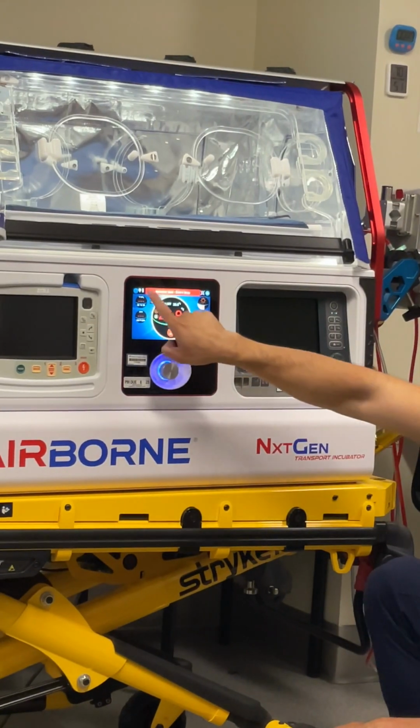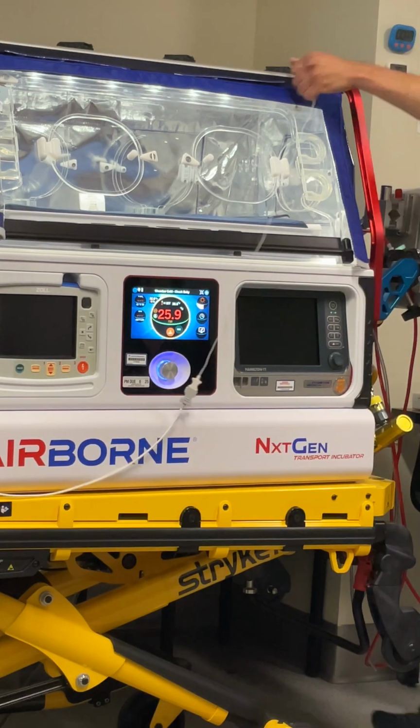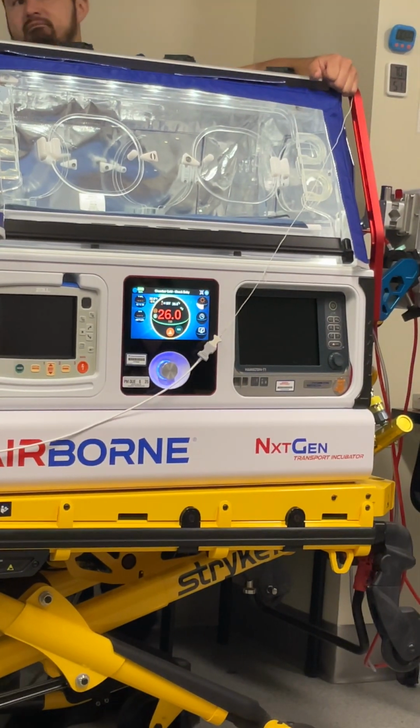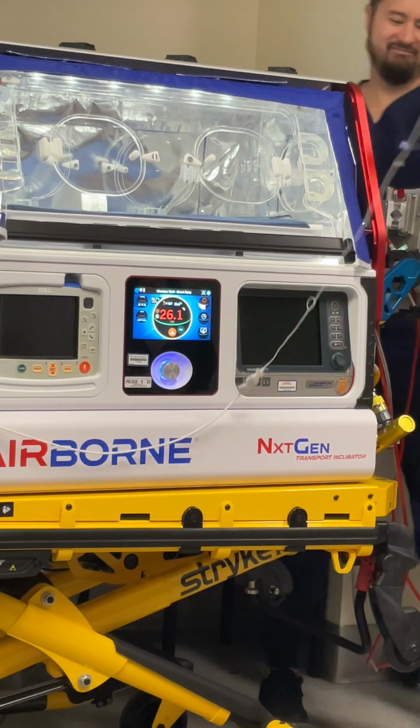Right now it's giving an icon that says it's been plugged in. If you want to see what it looks like when it's not plugged in, it's going to give you a percentage. I hope so, because if I unplug it, that would look bad.